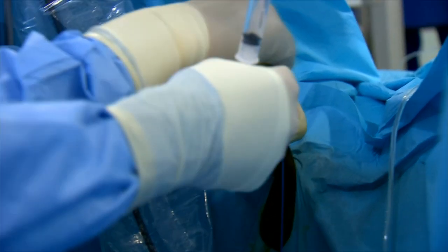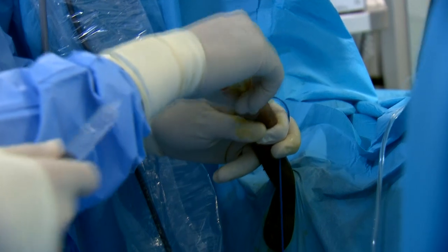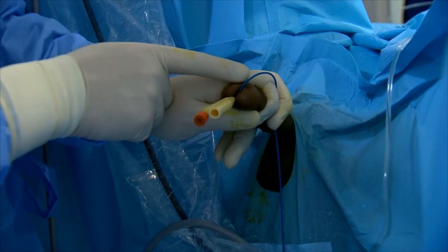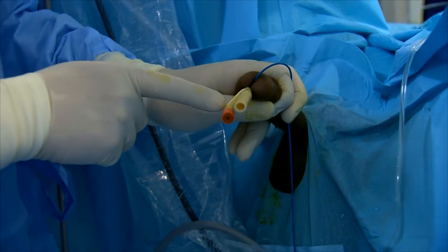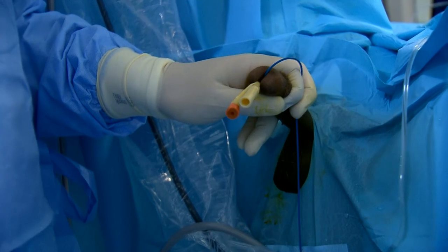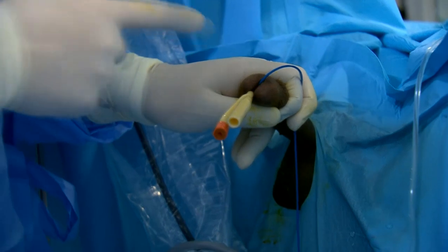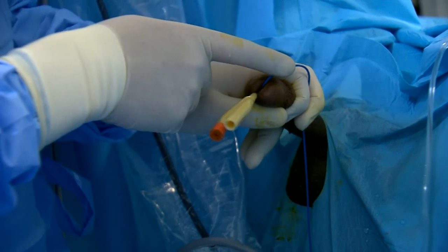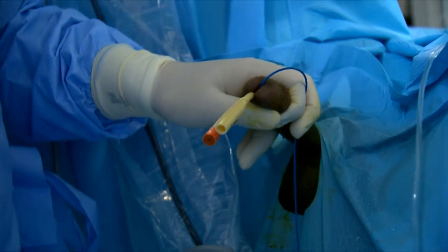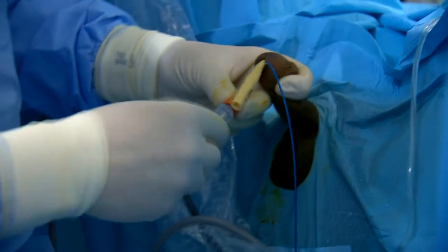What we do not do is any fixation between the ureteral catheter and the transurethral catheter. We keep it loose. This is an advantage. At the end of mini PCNL, with the patient in prone position, we can easily remove this catheter. This is the reason why we do not perform any fixation between them. That is too little, we need more.